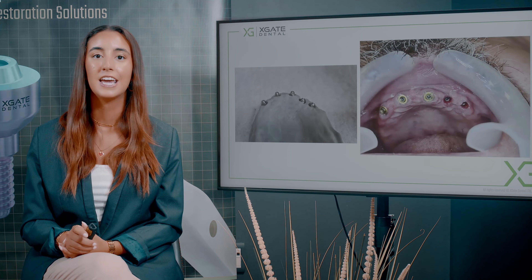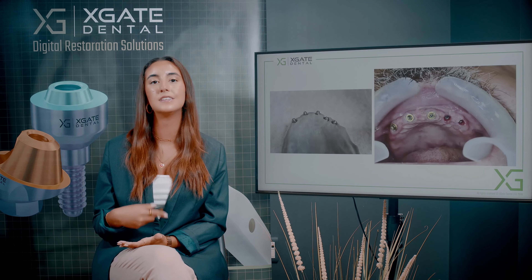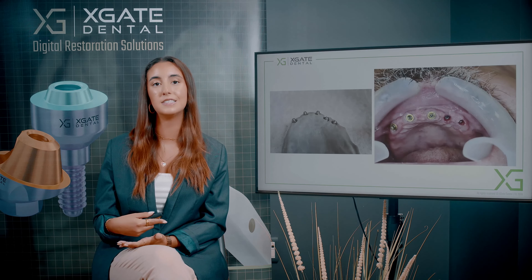You're probably wondering whether using a regular multi-unit would still leave space between the bar and the gingiva. Probably not, because the horizontal part of the multi-unit is still at the same height as the gingiva. You want some space between the gingiva and the bar so that when the patient removes the bar they can clean those areas. Less inflammation means a much higher lifespan for the implants. If the bar sits right on the gingiva, it's hard for the patient to clean it, so the patient needs more options to clean these areas efficiently.